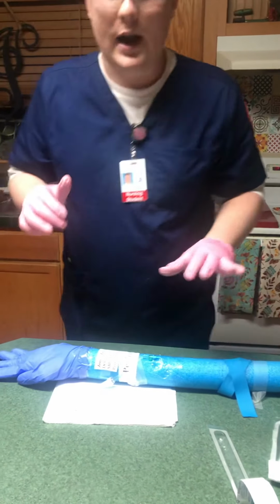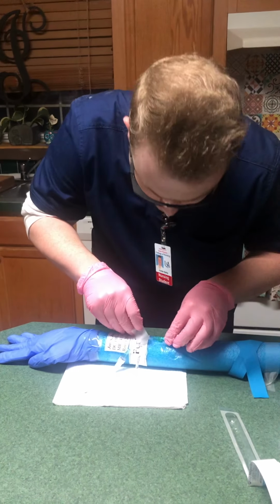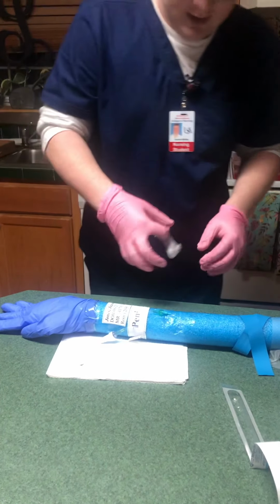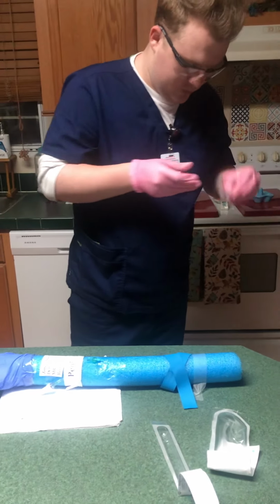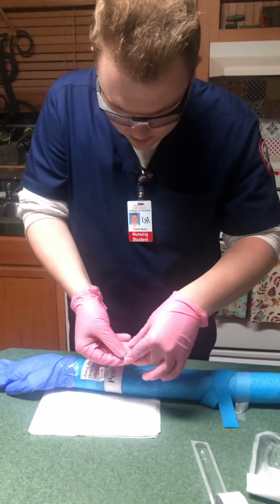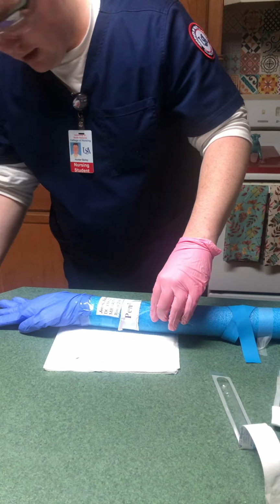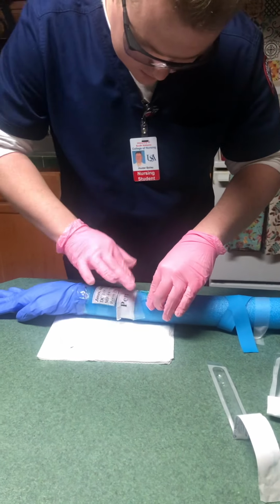So now, now that I have my Tegaderm over it, I can take my temporary tape off, but I'm holding the catheter to stabilize it. It's ripping my paper, but that's okay. And ball it up. Just place this in the trash. Okay, so now I'm going to allow the IV to maintain a natural position. And I'm going to take my final tape and place it over.